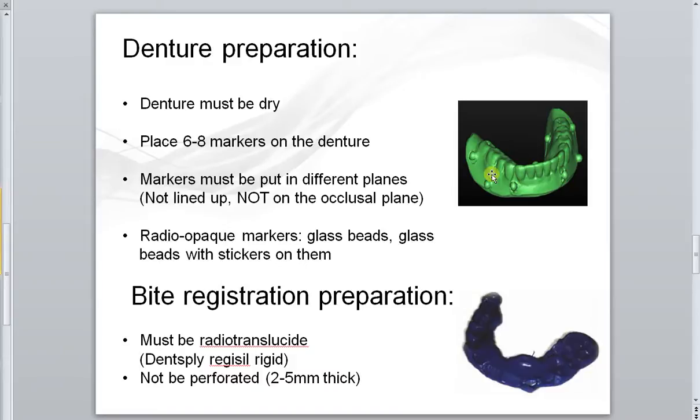The reason why we want to have that thickness is that we can use that bite registration afterwards to fixate the guide in place. Now, I'm talking about obviously the mucosa supported guide. So when you're positioning the guide, we will keep some teeth on the guide so that you can use the bite registration to position the guide in the exact position that the patient was scanned in, so that you're minimizing some errors here. Obviously, because it's a mucosa supported guide, the guide can move, and therefore if we're following the protocol and using the bite registration, there should be no problems.